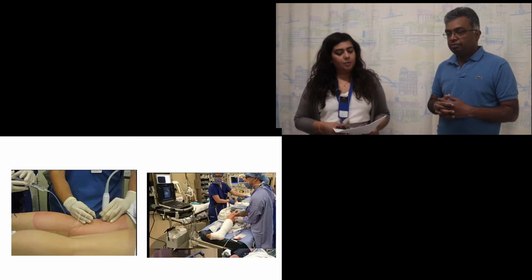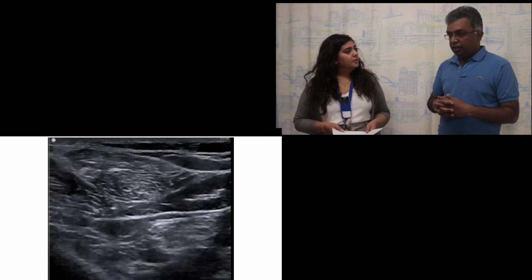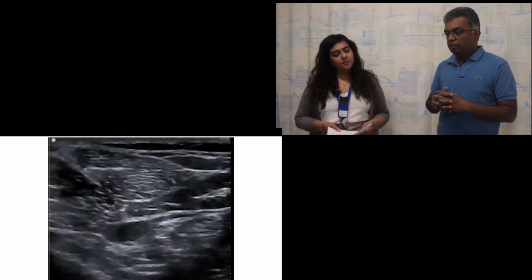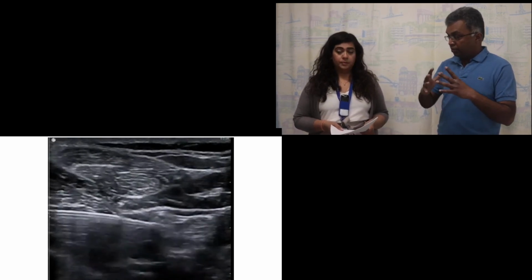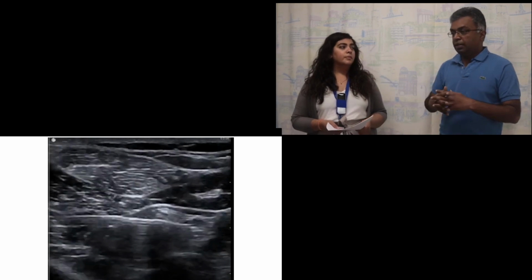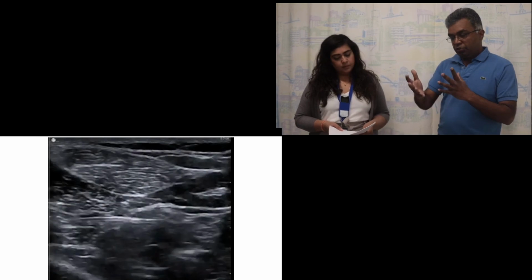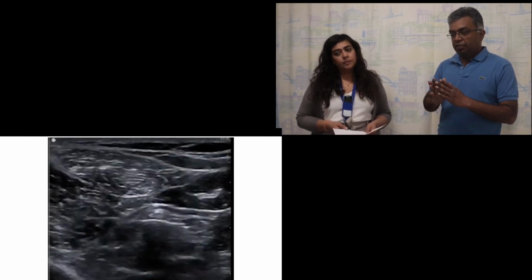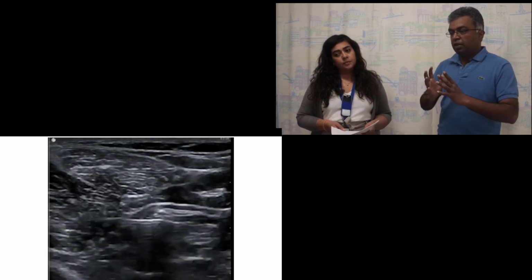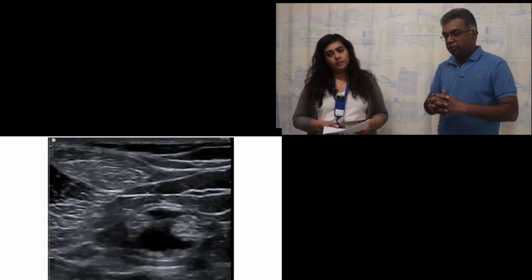How much would you inject, and any practical or technical tips? We try and avoid local anesthetics with adrenaline, because the sciatic nerve itself has very limited blood supply, so the blocks can last longer, and the patients, because of the motor block, can have a foot drop. As you see in the video here, the needle is inserted into the paraneural sheath, and you're aiming for the local anesthetic spread around both the common peroneal and tibial nerve, which is nicely illustrated in that video.